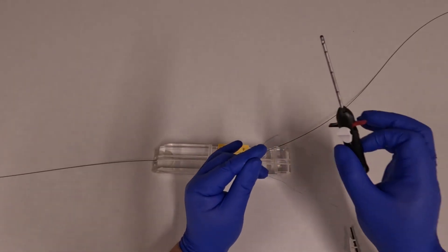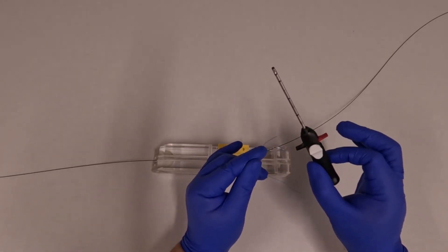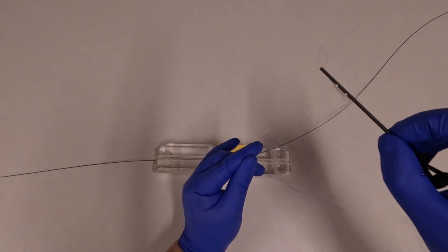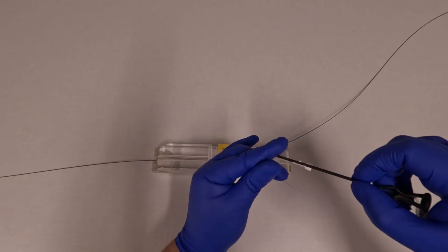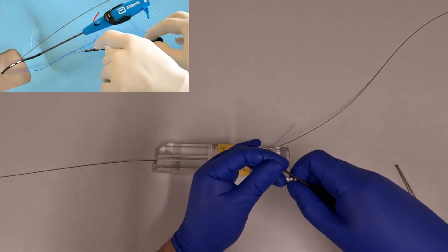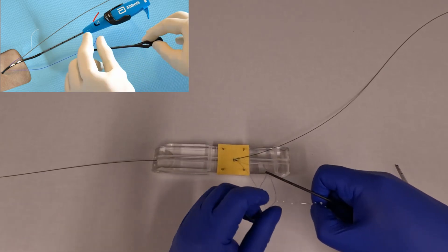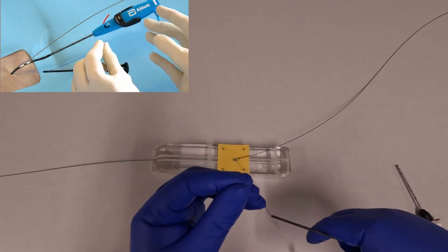Take the white suture. Some people will do all the steps using the suture cutter, but there is a suture puller available, so I'll show you how to use that. You pass the blue suture through the tip of the suture puller and then pull on the white tab that brings the suture straight through the suture puller.